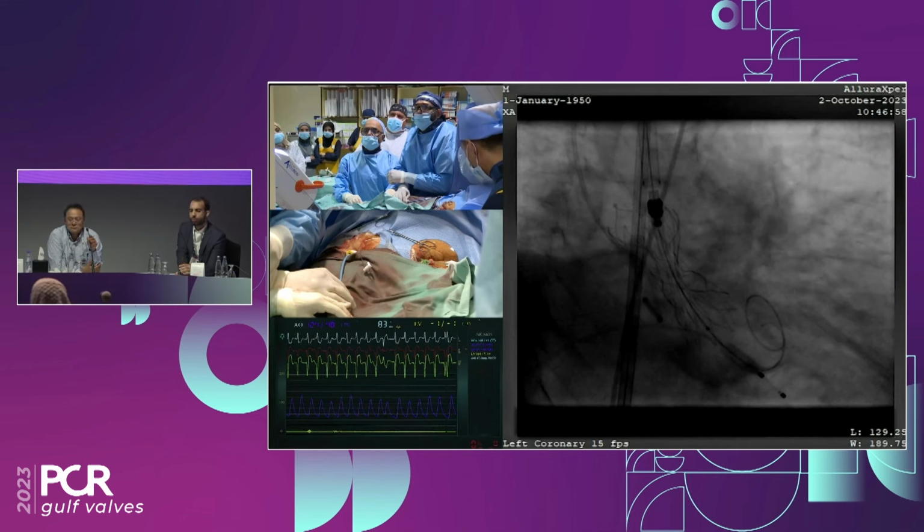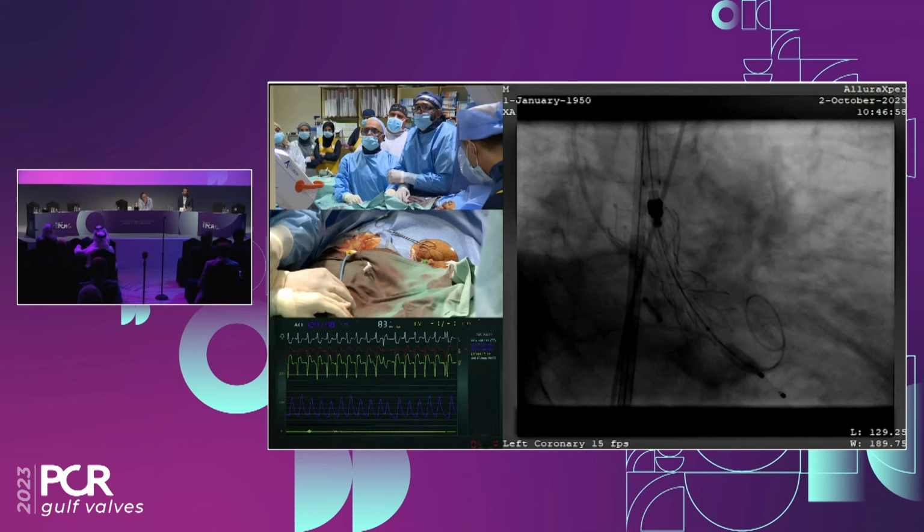But what you said is very important. When you see the frame like this, first of all, before releasing, you should go to an RAO caudal, just to make sure it's not compressed. But at this point, the most important thing is not to remove the valve with the nose cone. So you have to be very, very careful removing the nose cone. I was about to comment about the nose cone. I would be scared, to be honest, pulling the nose cone in this case. I think we'll take at least 3 minutes just to try to center the nose cone before pulling it. Otherwise, we might pull the valve. As for enfolding here, I think we had one case of enfolding before.